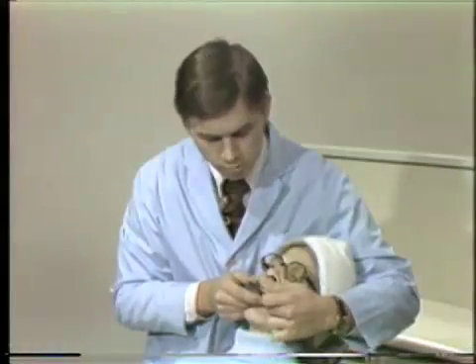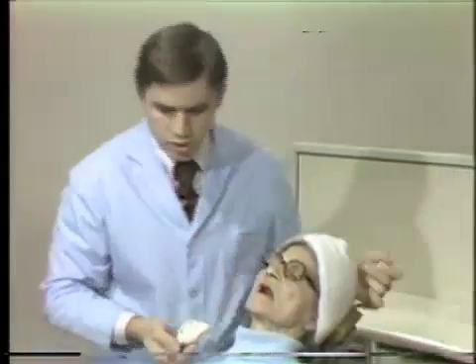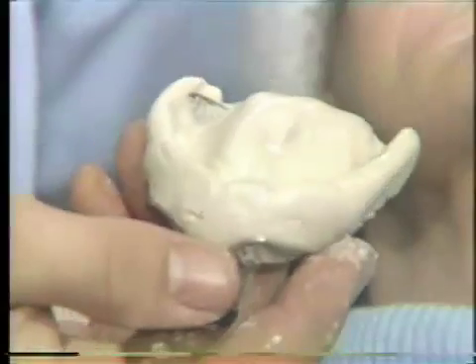This material takes about one minute to set, and when set it is simply removed from the mouth. This is the end result — the alginate impression, which captures the detail of anatomy we are interested in.